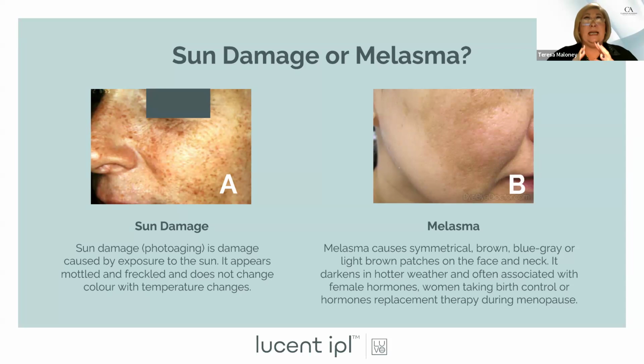When you're treating melasma, like I said, it's one and done, sort of, at that time. So you treat it, and then what you do is keep it as controlled as possible with other things that are not heat related, for skin care, sun protection, all those things. Because it is hormonally driven within their body, they're going to come back to you in 6 months, 5 months, 9 months, depending on how good they are with doing what they're doing on their end, or how their body is creating it, and going, I need another treatment.